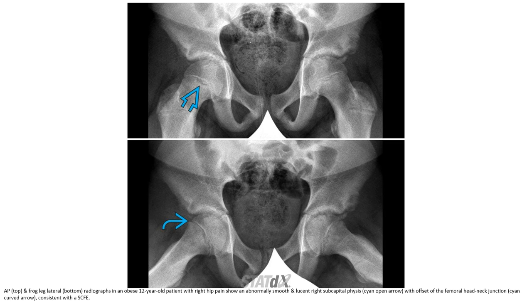AP (top) and frog-leg lateral (bottom) radiographs of a 12-year-old patient with right hip pain show an abnormal, smooth, and widened right subcapital physis with offset of the femoral head-neck junction, consistent with slip capital femoral epiphysis.